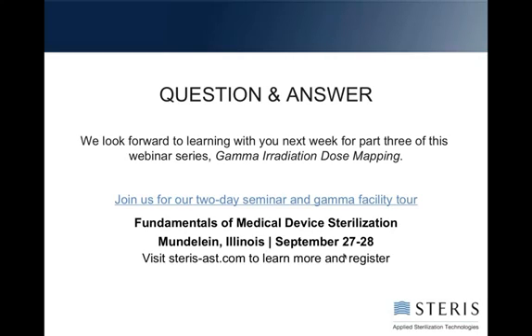That's a huge increase. It also means that you're not getting a very accurate idea of just how many bioburden units you have. So to try to improve it is to your advantage. In most cases, if it's over 50%, most people are not going to repeat it. But you want to be aware of that number, because a lab, when they see a number that low, will come to you and say, do you want us to repeat it?